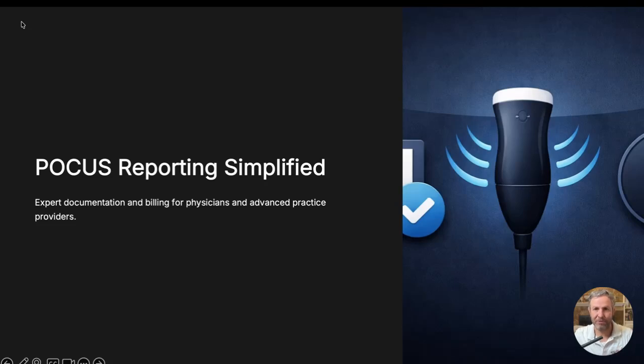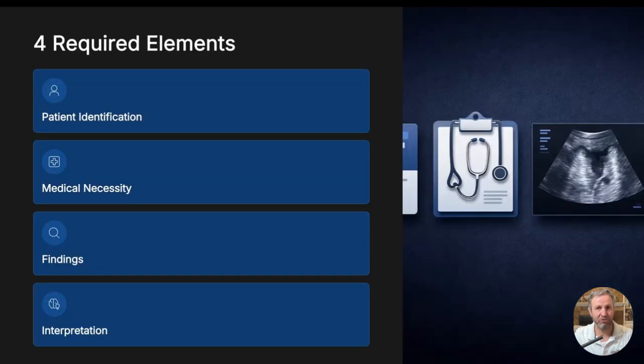Let's simplify POCUS reporting. If you want clean documentation and clear communication, your report needs to be structured and complete. And here's what actually matters. Every POCUS report should include 4 core elements.